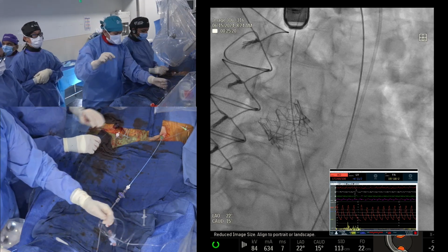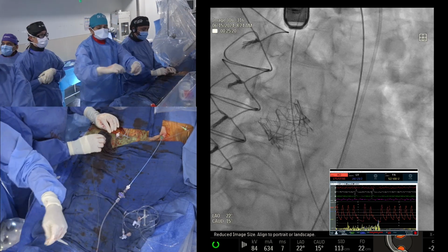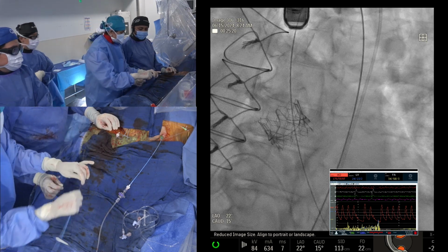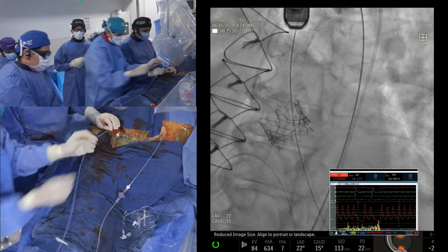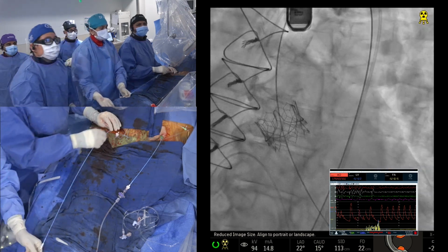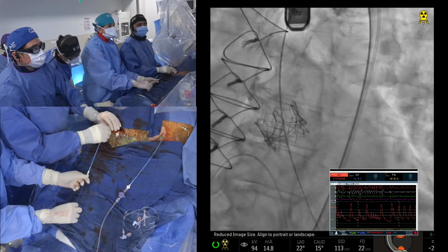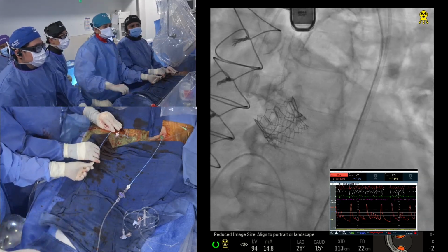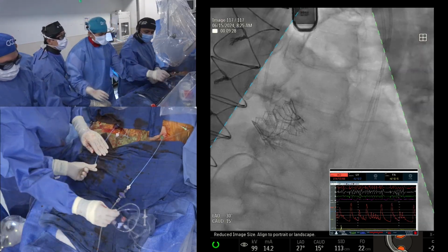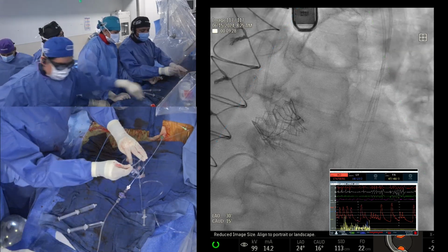That was a nice demonstration. I think the distal flex allows you to keep it coaxial before inflating, and that's a perfect demonstration of that. Especially when you're doing valve in valves, it will cant towards one side. So the advantage of the distal flex with Edwards is that you can keep it coaxial even before deploying, and very slow deployment is the key. It allows it to contact with the surgical valve.